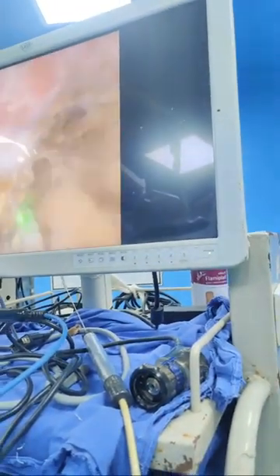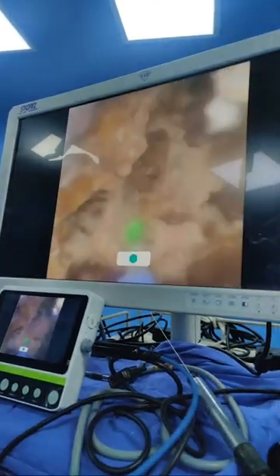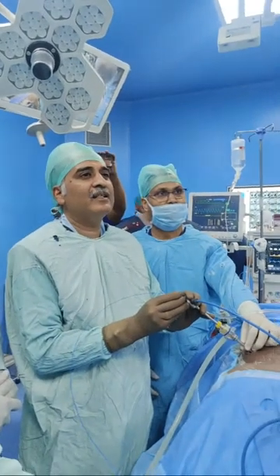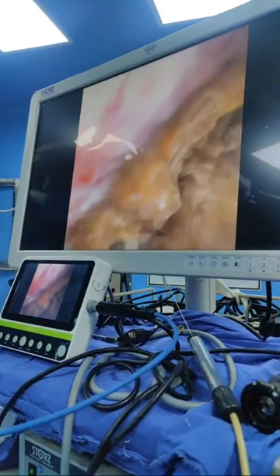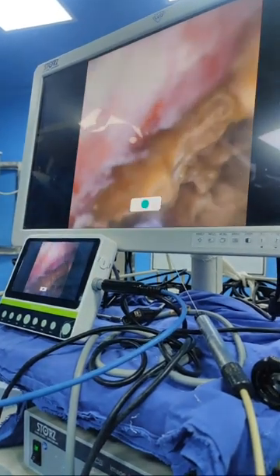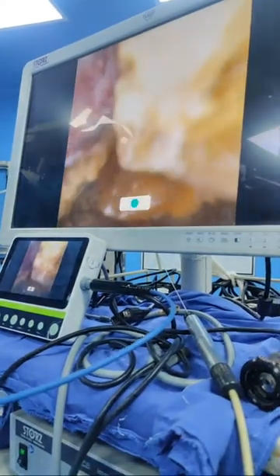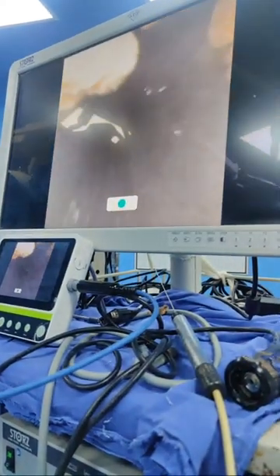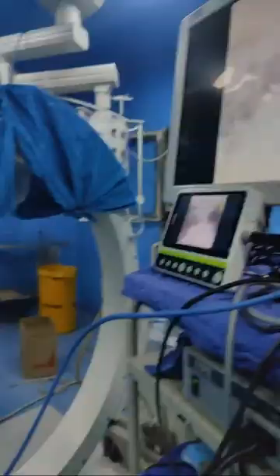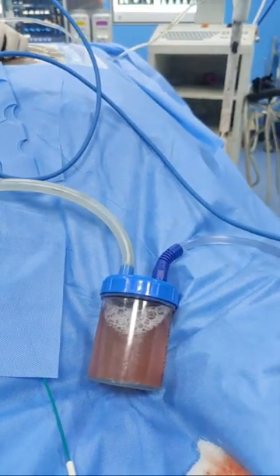So we are trying to keep the laser fiber away from the mucosa so that we cause the least injury to the pelvicalyceal system, as somebody had just asked on YouTube. So this is how you just remove those fragments. These come up and they go into the tube. With one passage of the scope, a lot of fragments come out.